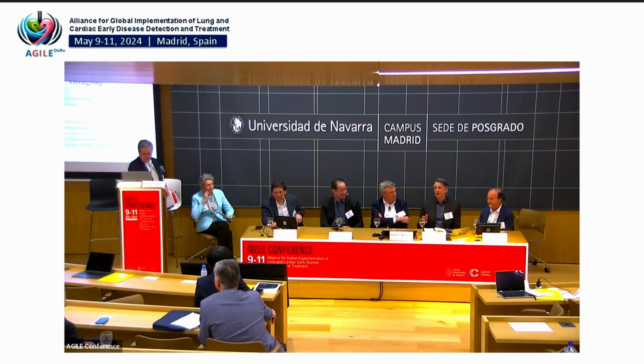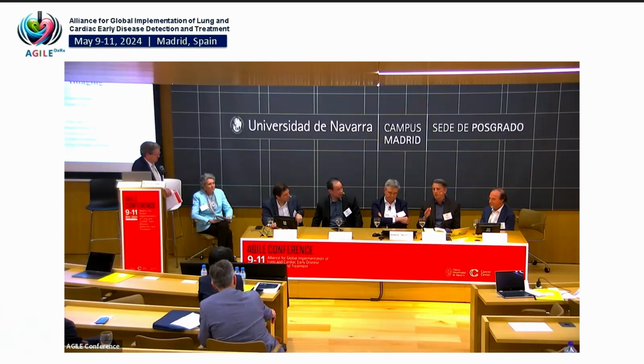It's true that -950 is a very antiquated threshold, and it basically found purchase because of that paper comparing to histology, in resected lung that they were identifying. There's no reason why -950 is magic, and to explore other thresholds makes sense. To say that there isn't any research in this, I want to comment on a couple of things. There are a number of different efforts trying to get away from the histogram-based approach, looking at multiple inflation states.